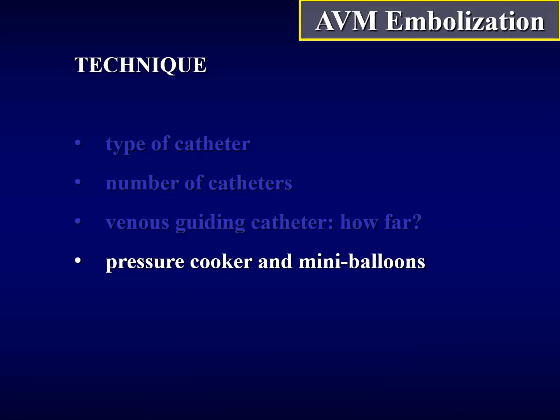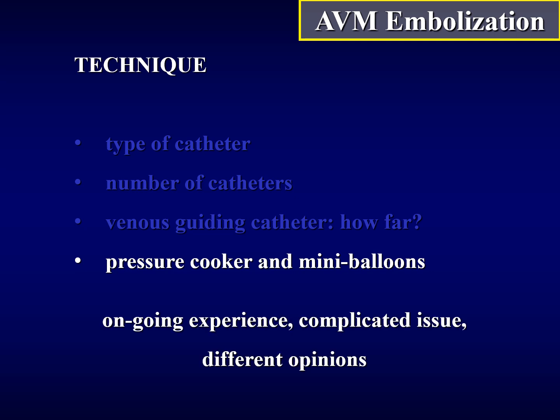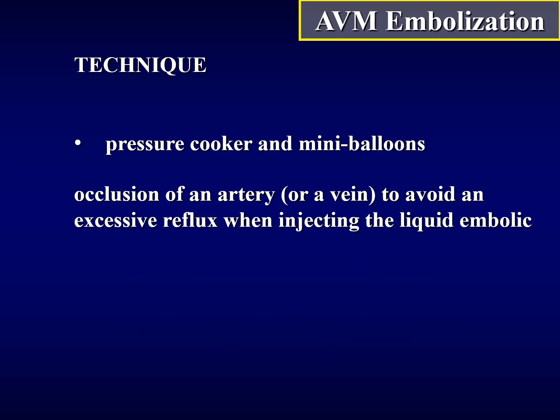Pressure cooker and mini balloons are recent improvements in AVM embolization, but for that reason it's an ongoing experience. It's a complicated issue and we have different opinions about it. So what is a pressure cooker?